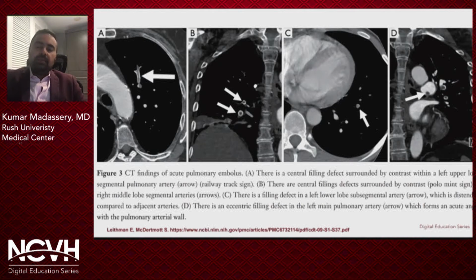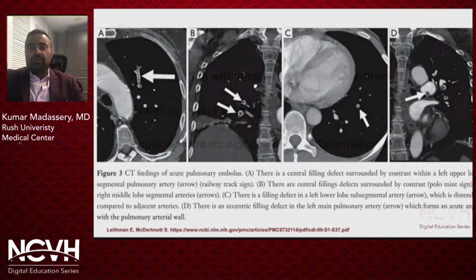Now, chronic PE, how that looks: a lot of times, you'll see peripheral eccentric clot circumferentially surrounding the vessel. So if you see filling defects, it's not in the central part, there's contrast going through. However, if you see circumferential thrombus-appearing material, that's usually chronic. That can also become calcified. That gives you another clue. But on top of that, you may have acute clot because a patient can have multiple episodes, since a lot of this travels from the lower extremities and so on. So this just shows you how you pick out acute versus maybe chronic. But again, the clinical picture of the patient who comes in with tachycardia, short of breath, and some of the other classic findings gives you a better clue than anything else.